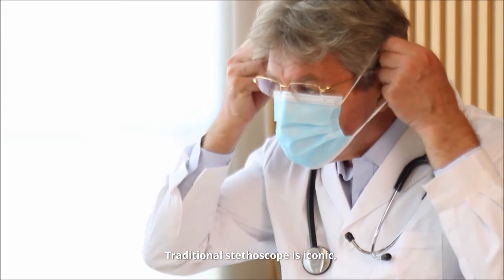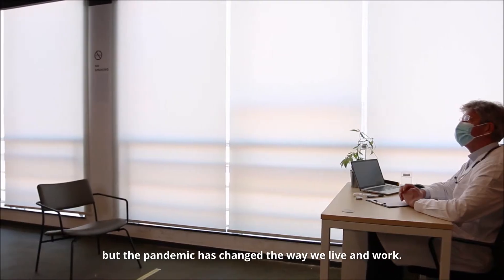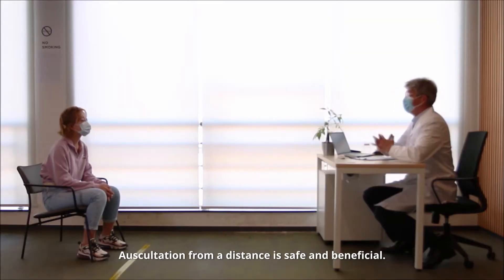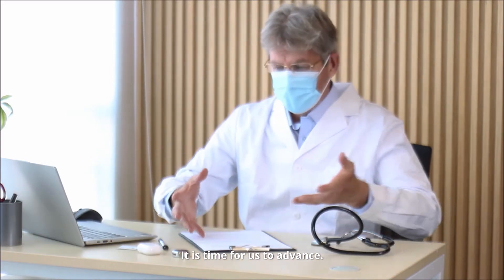Traditional stethoscopes are iconic, but the pandemic has changed the way we live and work. Cross-infection needs to be avoided. Auscultation from a distance is safe and beneficial. Compliance with the PPE protocol is needed. It is time for us to advance.